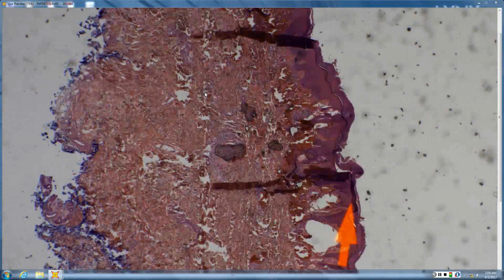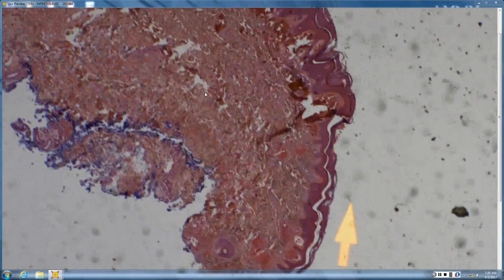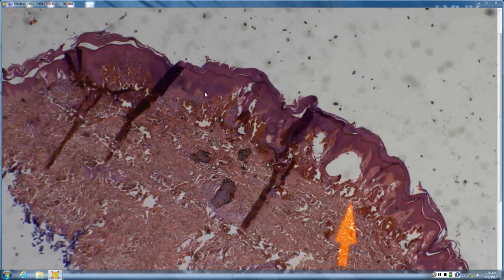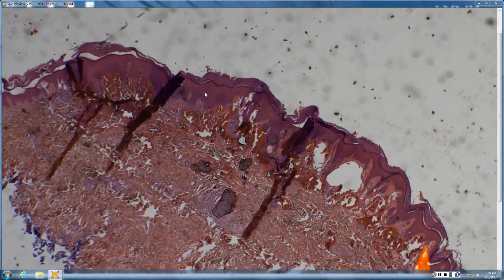And this is another angiokeratoma. This is the last one, number 18. Here again you can see that it has almost a seborrheic keratosis-like architecture. The first one was even better because it had that little horn cyst. But it's this very bloody, almost hemorrhagic look to it.